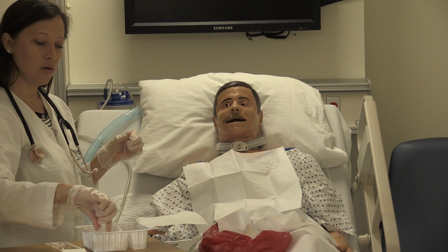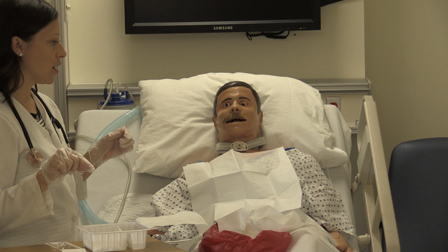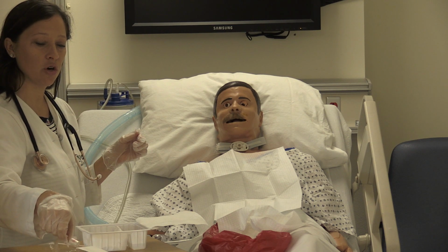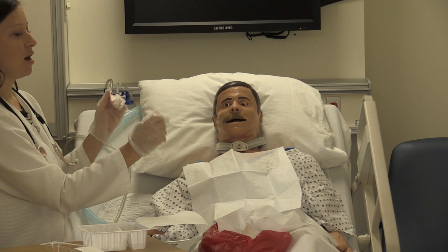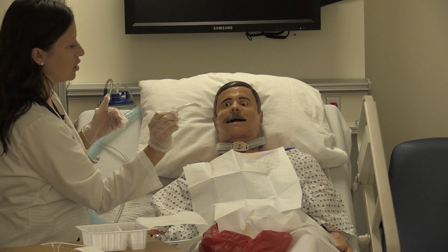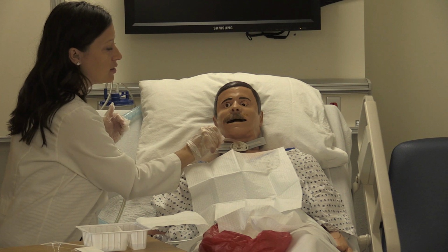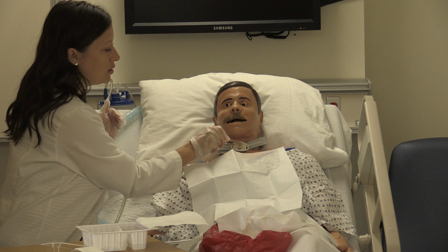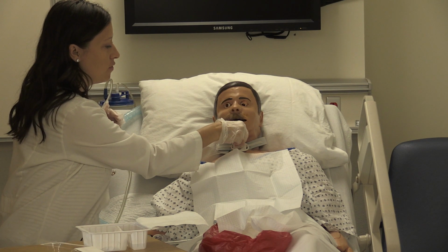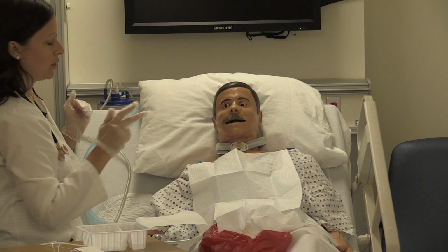The last thing that you need to do, before we put the dressing on, is an easy part to forget, because you need to now reach into your inner cannula container and replace the inner cannula. So this is a new inner cannula. Okay, Mr. Smith, I'm just going to insert your new cannula. You see that it's kind of curved, so you kind of put it in sideways like this, and then you turn it and it will just follow the curvature of their body. And you just push it in until it clicks.